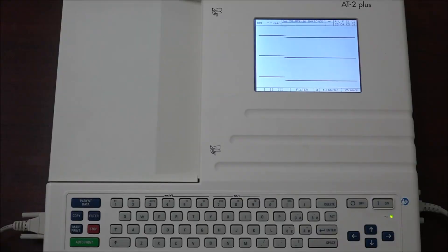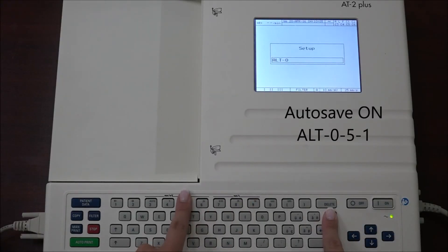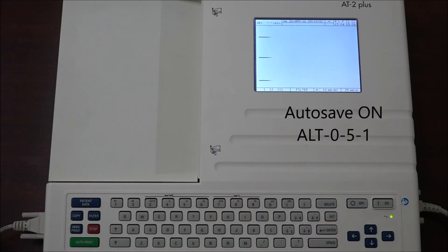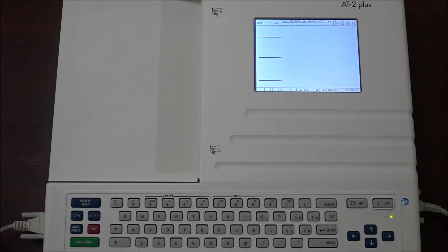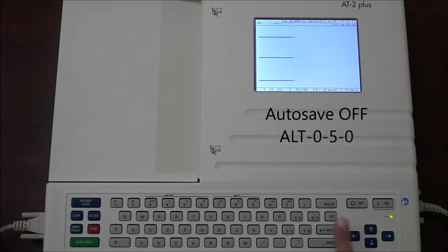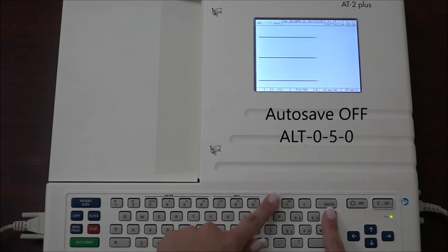In order to automatically save all the recordings, press ALT 0 5 1. To set the auto save to off, press ALT 0 5 0.